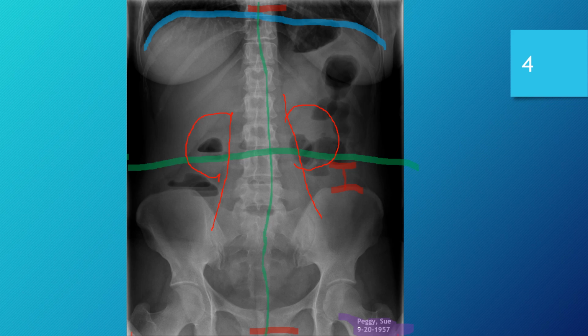As we all know, anatomical markers are so very important, but we can note that there is a partial patient reference information, but we do need the medical record number to make it complete. Okay, we'll move on to our next image in just a moment and keep this rolling.